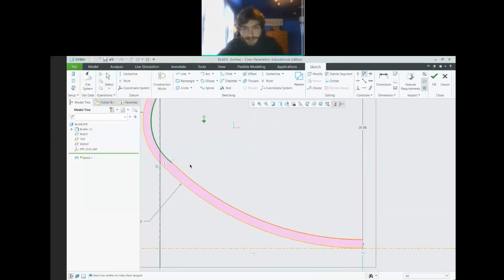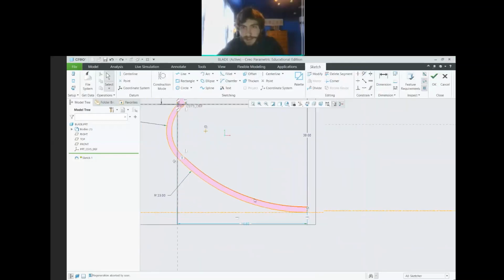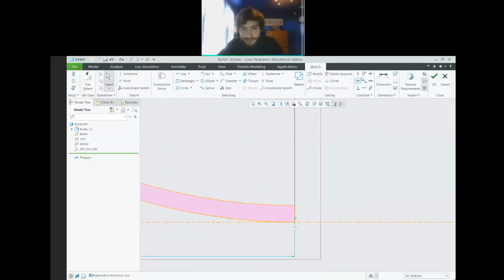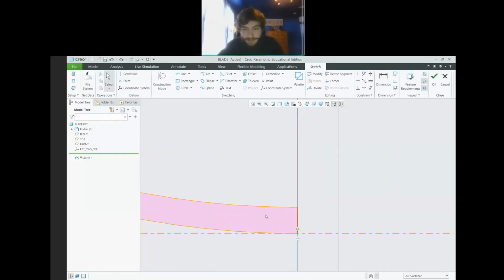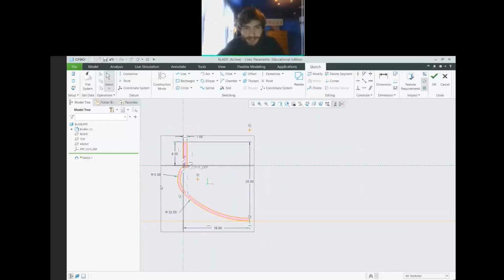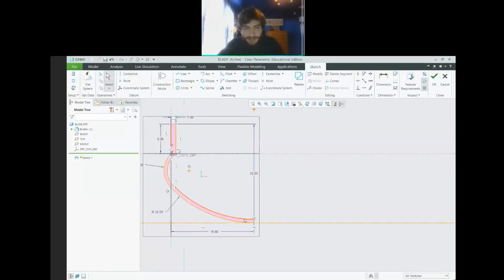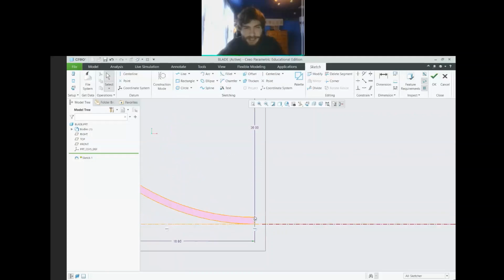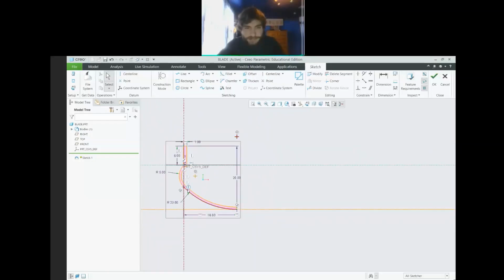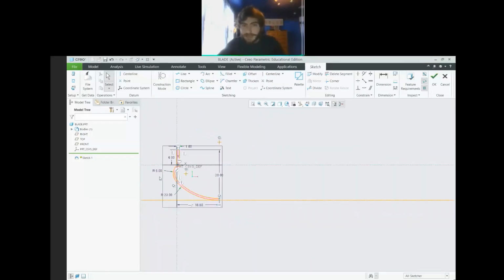This constraint will help it. Nope. We'll do a vertical constraint on, really, I can't get points either. Fine, it'll just be the dimension it wants to be. For some reason, it's wanting this point to be independent of everything else. And I'm not quite sure why I can't constrain it properly.